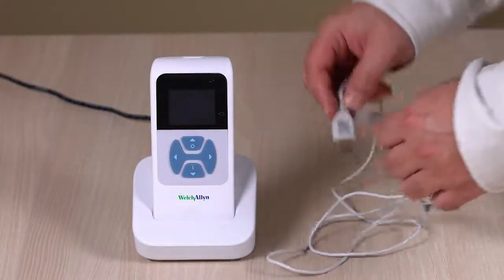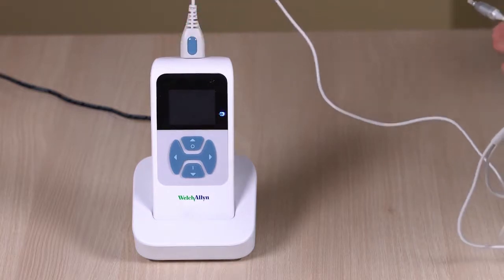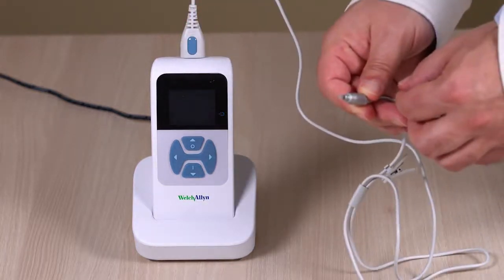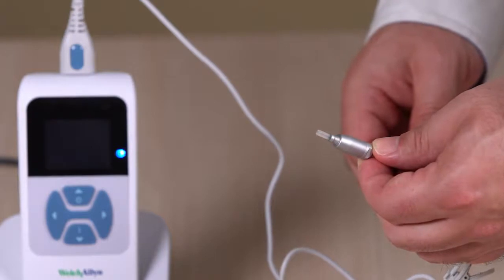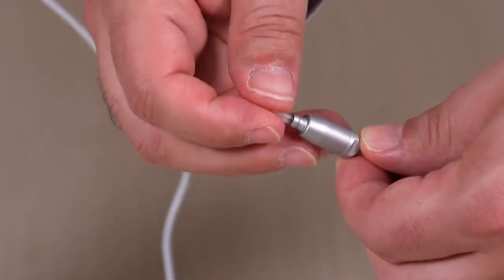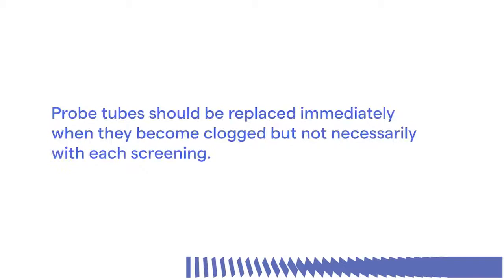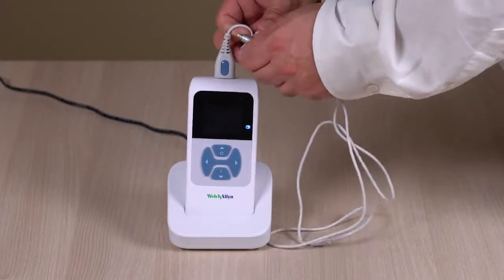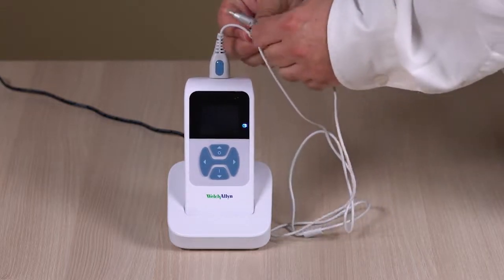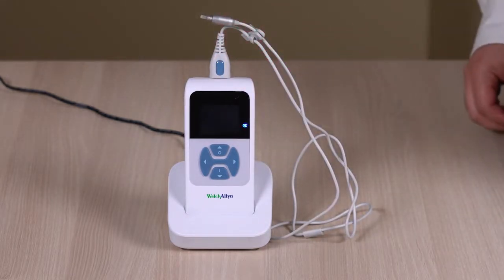Next, install the probe. Insert the probe connector into the socket on the top of the screener. A clear probe tube must be attached to the probe head before an ear tip is applied. Insert a new probe tube into the probe head until it is fully seated and snaps securely into place. To remove the probe tube, grasp the tube and pull gently away from the probe head with a slight twist. Probe tubes should be replaced immediately when they become clogged, but not necessarily with each screening. Finally, place the probe holder near the end of the probe cable, and gently press the probe cable into the probe holder close to the point of the probe head. Return the probe to the probe holder for safekeeping.